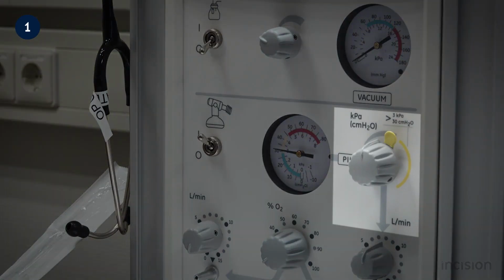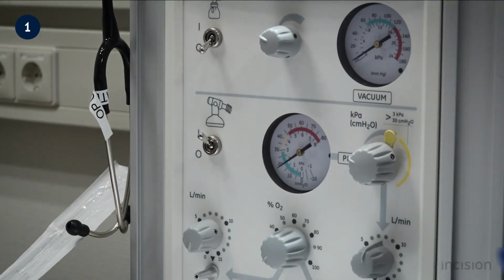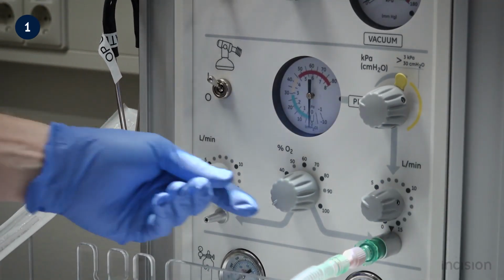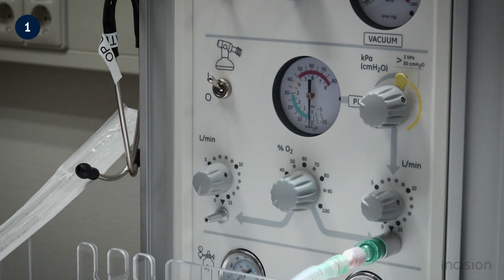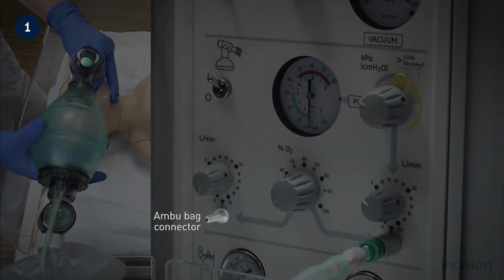Here the pressure can be adjusted by rotating the dial. The flow rate per minute can be adjusted at the panel. The percentage of oxygen delivered can be adjusted from 21 to 100%. A self-inflating resuscitation bag, also known as an AMBU bag, can also be connected.